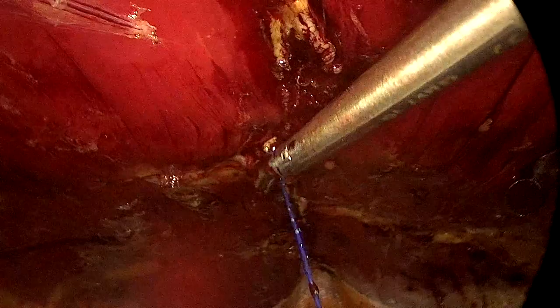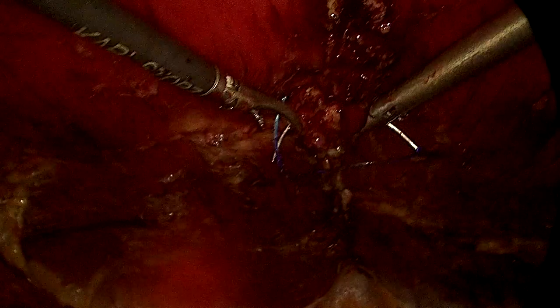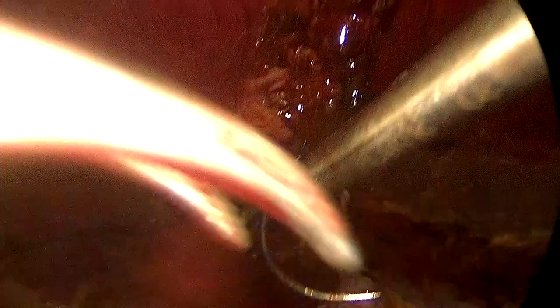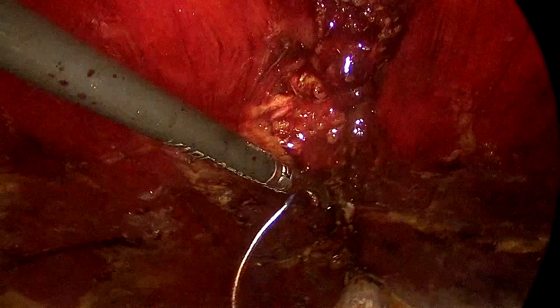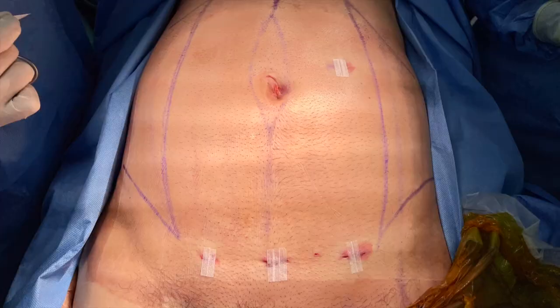Once I'm done closing the defect, I run the suture back through the same way I came in. That's the end of the case — we take out the needle from the abdomen, put in a mesh, and this is the way the abdomen looks at the end of the procedure. I hope this is helpful for surgeons out there trying to start their learning curve in eTEP rives-stoppa. Thank you.